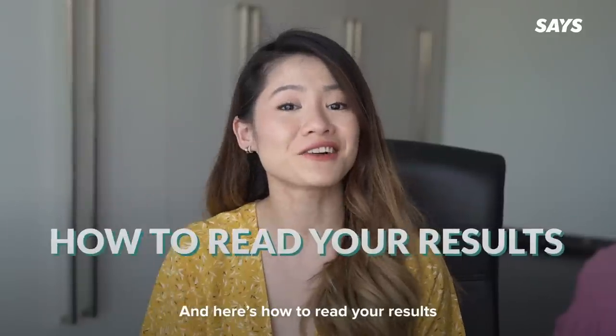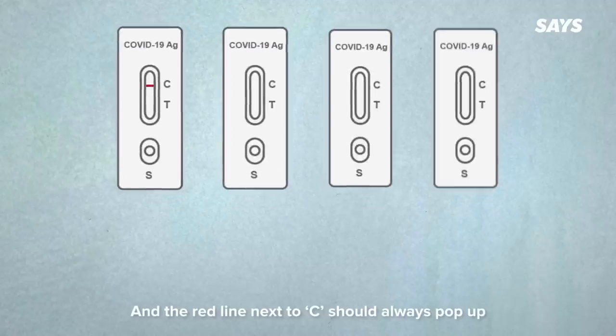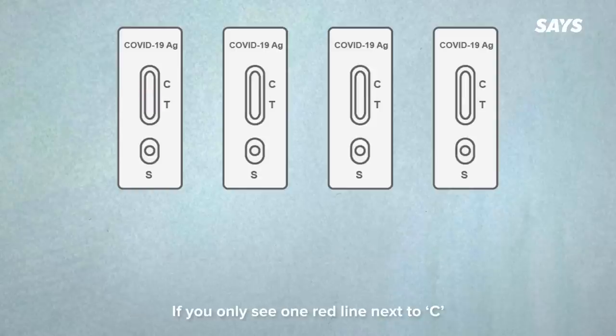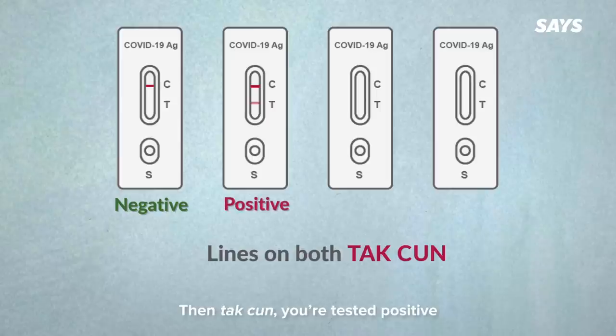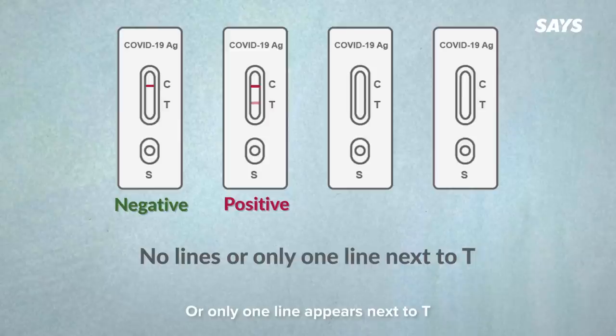Both results read the same and the red line next to C should always appear for a valid result. If you only see one red line next to C, then you have a negative result. If you see two lines next to T and C, even if faded, then you're tested positive. But if no lines appear or only one line appears next to T, then your result is invalid and you should take another test.